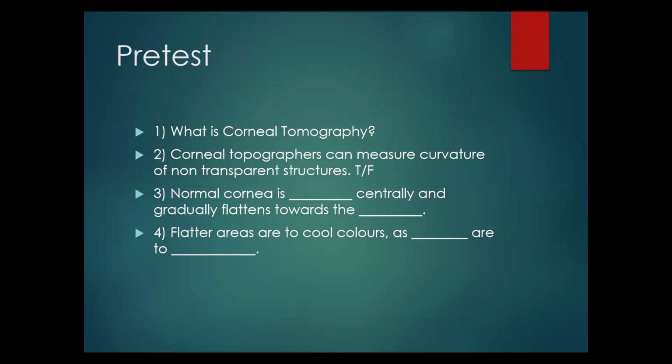Instantly when I saw the question, Prof, I went straight to answer topography. I had to look at the question again carefully before submitting. I saw tomography. Wow. To change the answer instantly, because I thought, what business do we have with tomography in the CTS? Exactly. So my immediate response was just topography. Sorry, it's topography I'm seeing. I'm not seeing tomography, Dr. Osazee. I know.